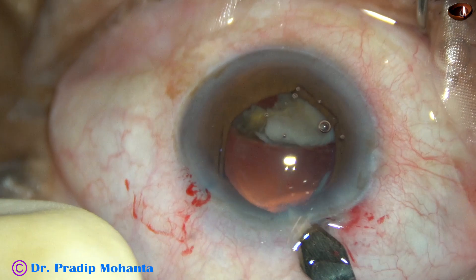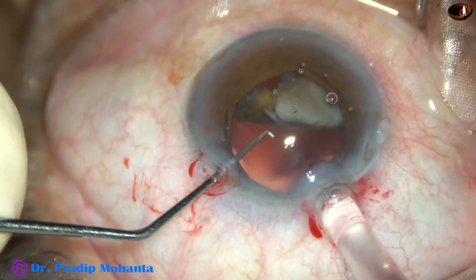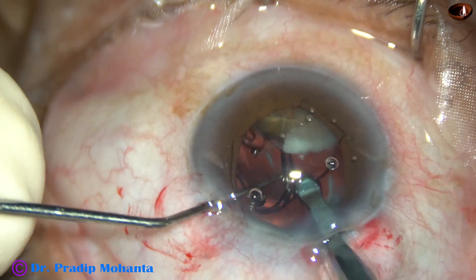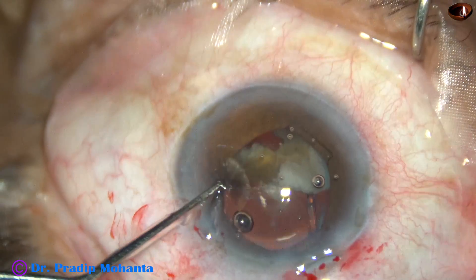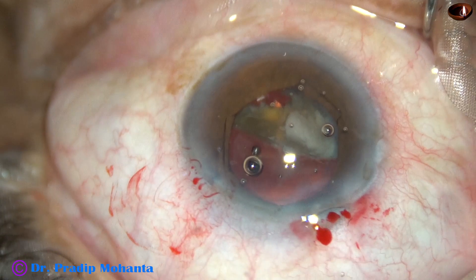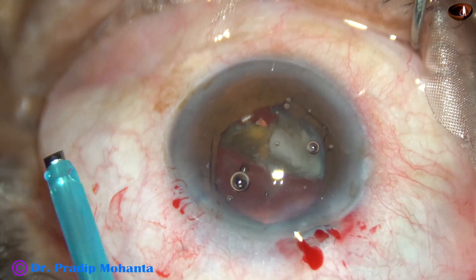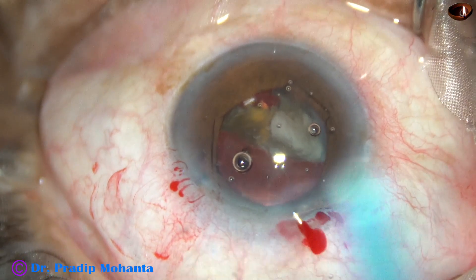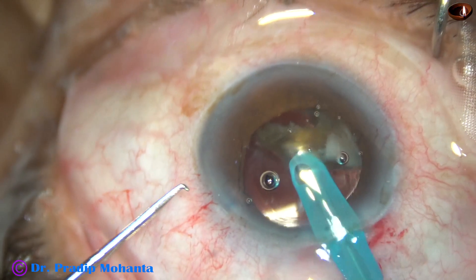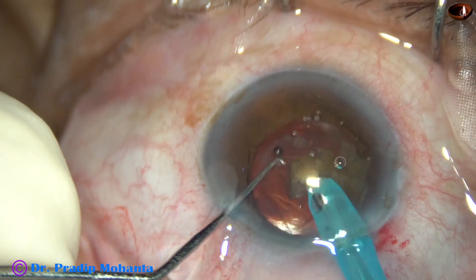And when there is a B-hex, enlarge the main wound a little bit so that you can deliver the nucleus in the bag and the haptics don't catch on the flanges of the B-hex which is above the iris. And now the posterior capsule is nicely protected. I am going to decrease the exposure of the tip of the phaco needle and emulsify this fragment. I am 100% sure that the posterior capsule is nicely protected.